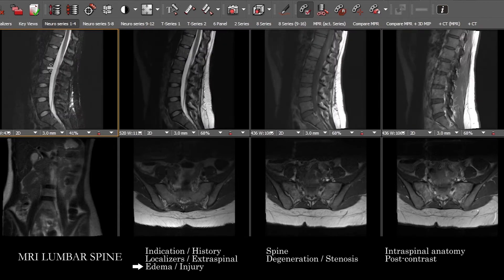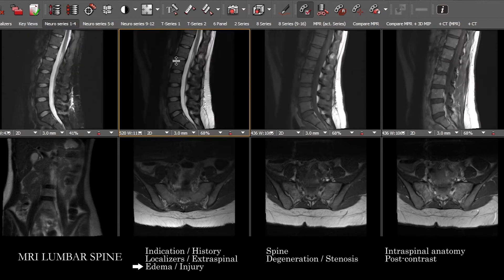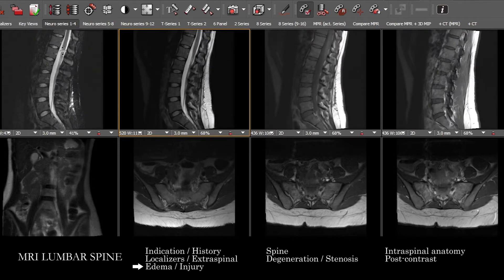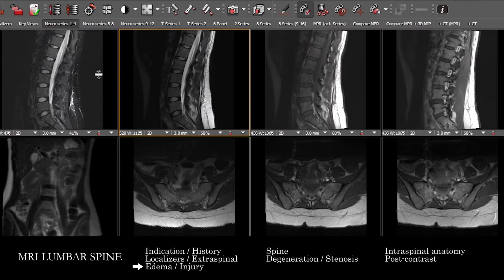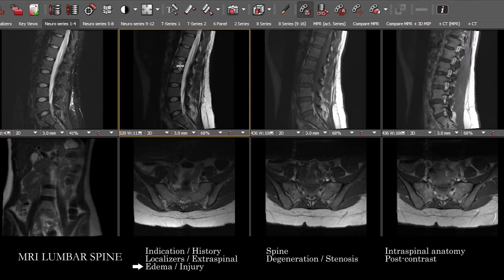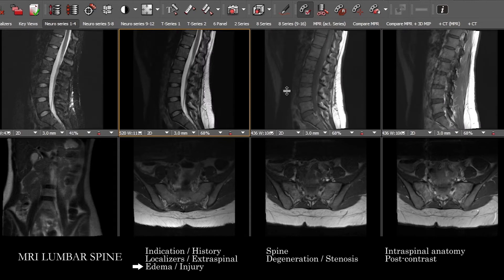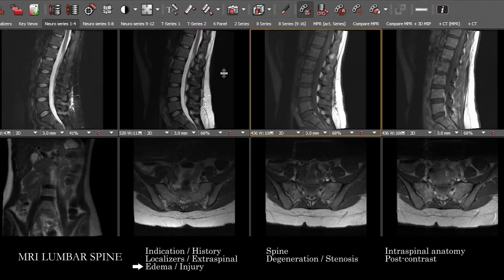The T2s also provide some sense of fluid signal, but have better resolution than the STIR — less noisy — so these are going to be more of a workhorse to delineate the anatomy, along with the T1s.